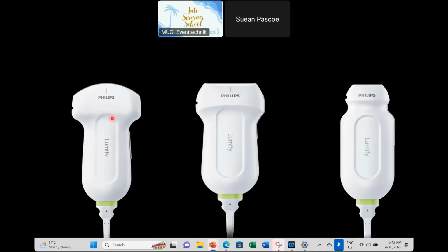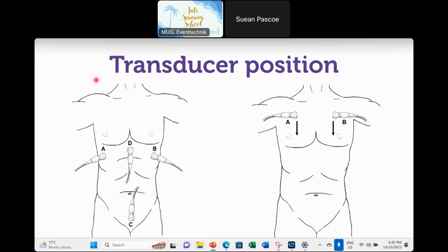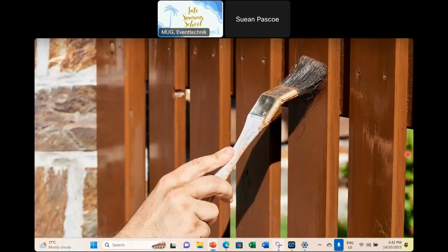Because it gives me great detail about the abdomen, I can get the subcostal views of the heart. And if I change my depth, I'm going to get reasonable views of the pleural line. So the 6 views that we are going to do are the right upper quadrant, left upper quadrant, the pelvic exam, the subcostal view of the heart, and then we're also going to have a look at the anterior chest wall, looking for pneumothorax.